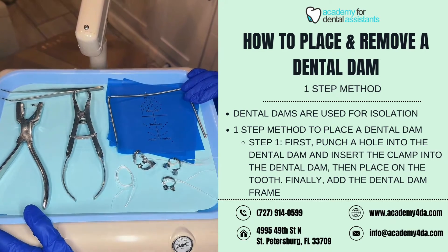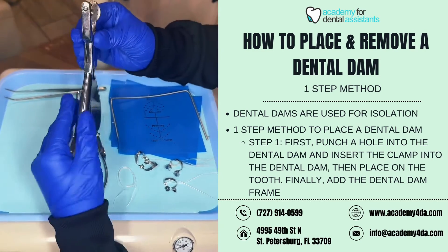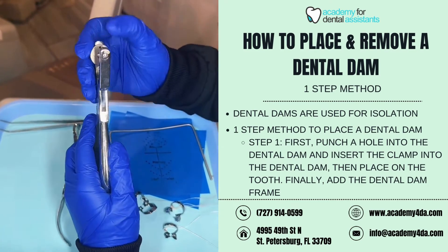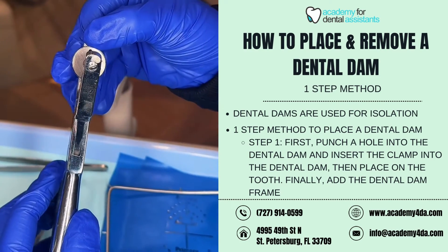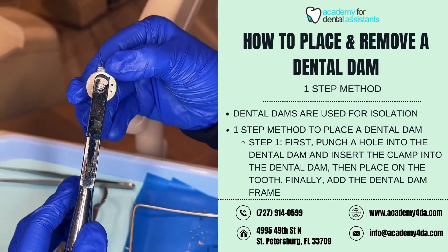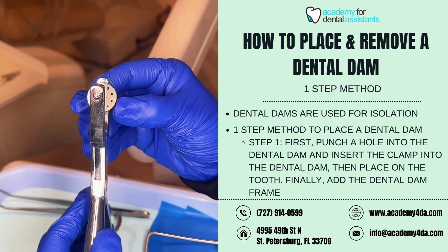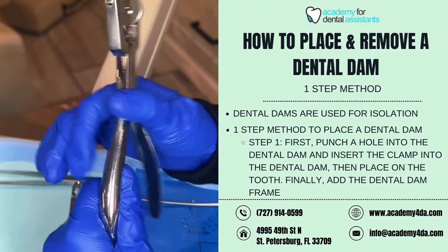Some of the instruments you may see on a tray setup for a dental dam include our dental dam punch. Our punch has different size holes — it goes bigger to smaller. Our bigger hole is going to be used for our molars; as it gets smaller it goes to premolars, and then our anteriors such as canines and incisors.